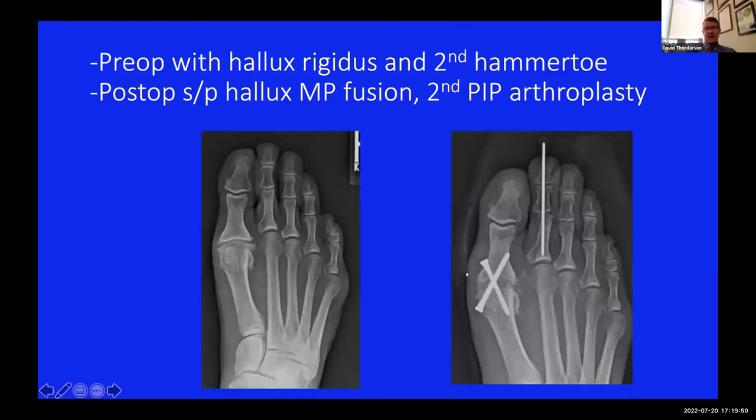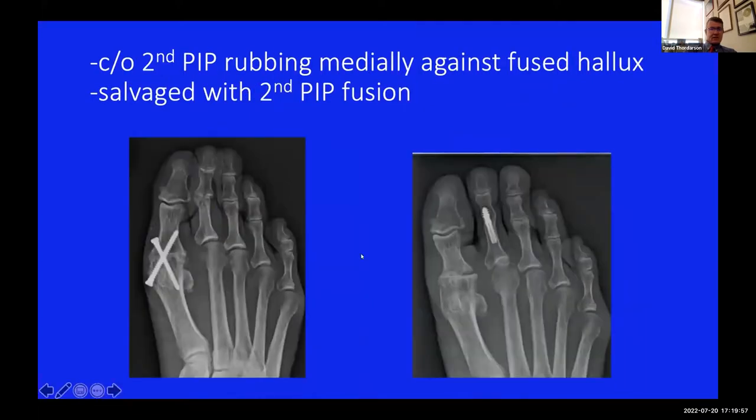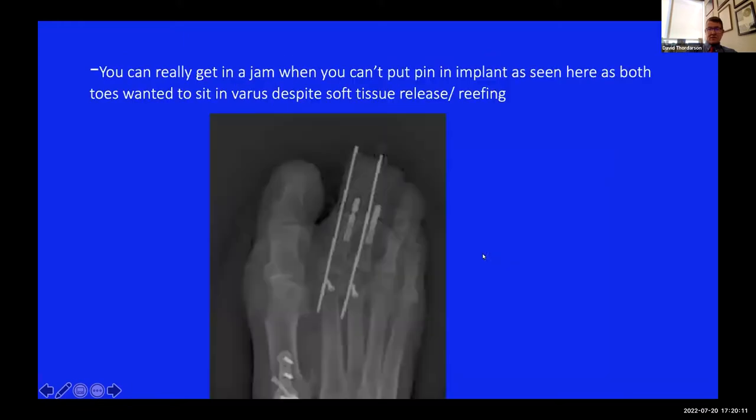Here's another patient who had a PIP arthroplasty and a fusion done pre-op. The fusion ended up in a bit too much valgus, the toe molded, and even though the patient was happy with the fusion, the PIP joint was rubbing on the great toe. This had to be revised with a fusion - now the patient is completely happy. Another problem with solid implants: this is an intraoperative fluoro shot where I'd already done my Weil osteotomies and wanted to augment alignment with pins forcing the toes into slight excess valgus for the first few weeks. But you can only run pins through soft tissue because you can't get them down the bone with a solid implant.